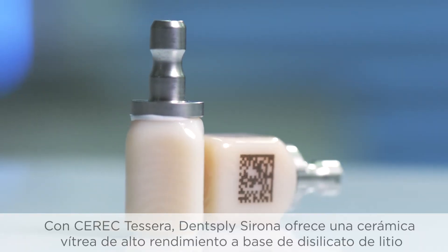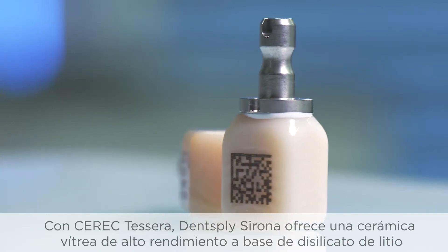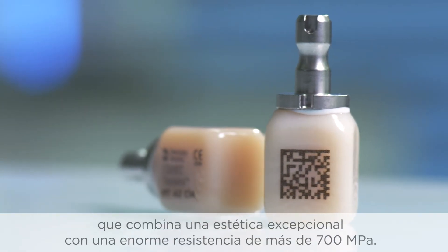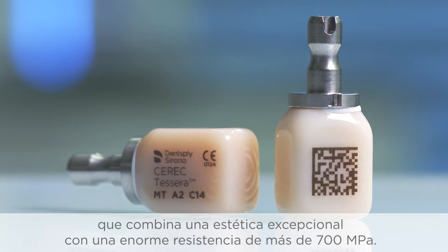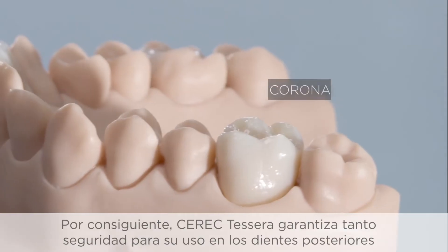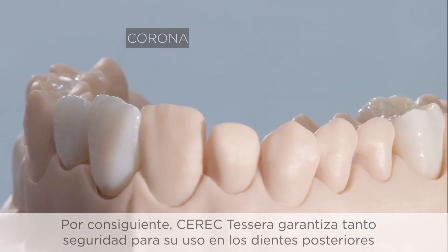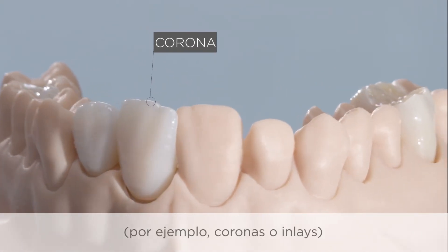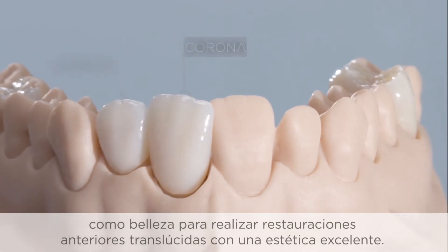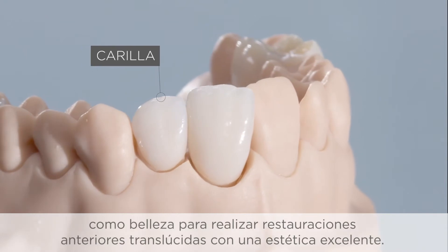With Seric Tessera, Dentsply Sirona offers a high-performance glass ceramic based on lithium disilicate, which combines maximum aesthetics with the highest strength of over 700 megapascals. As a result, Seric Tessera offers both the safety for use in posterior teeth — for example as crowns and inlays — and the beauty for highly aesthetic translucent anterior restorations.